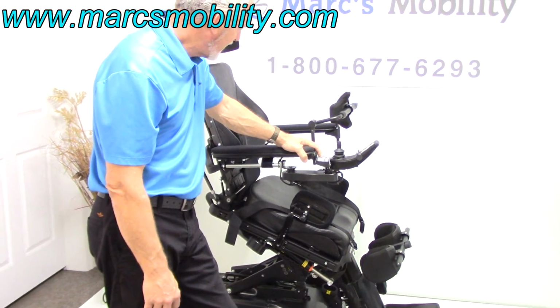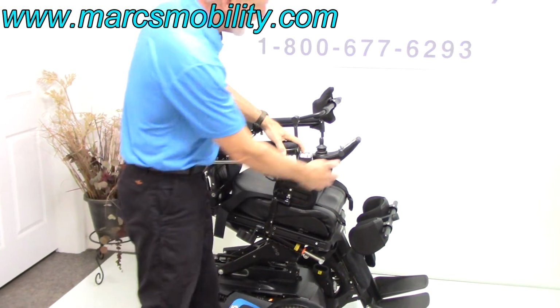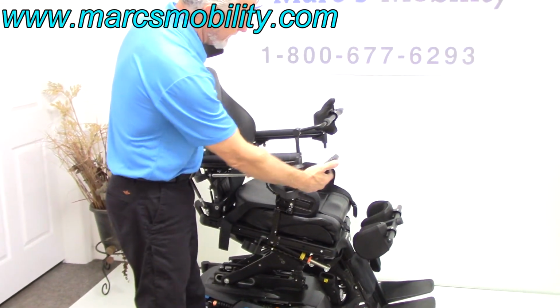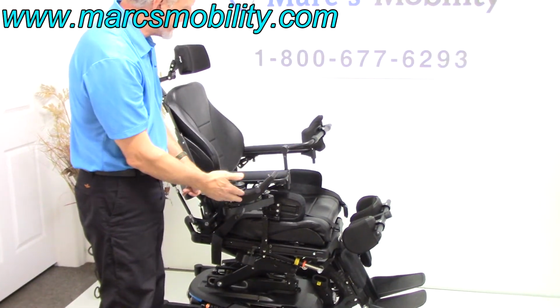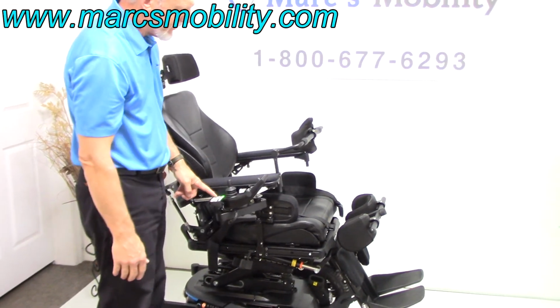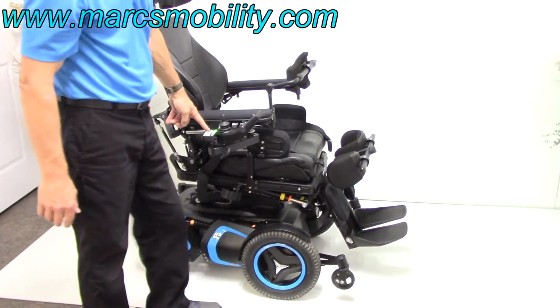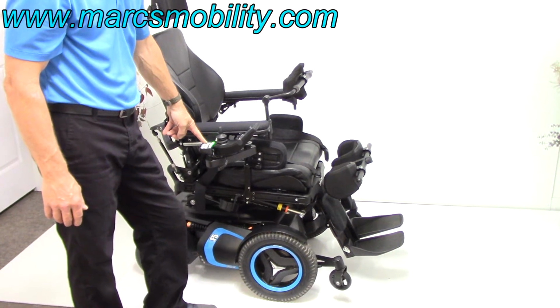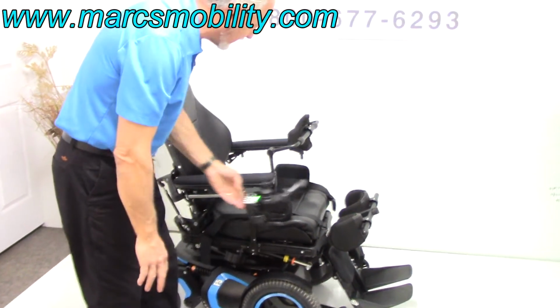So now we're bringing the standing feature back down. You have a swing away joystick on this chair. You can swing the joystick away from the side, from the front to the side, or we can change it to the opposite side also. Notice the wheels came back up now. And now we're going to bring the seat all the way back down. The seat is about 22 inches when it's down, okay?